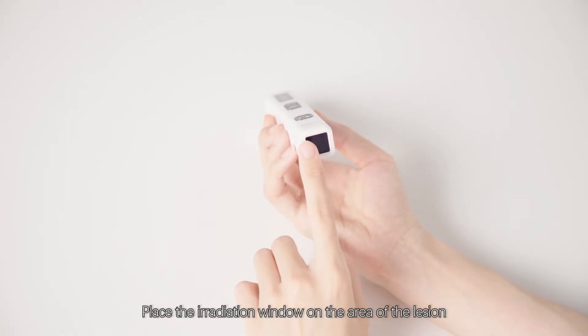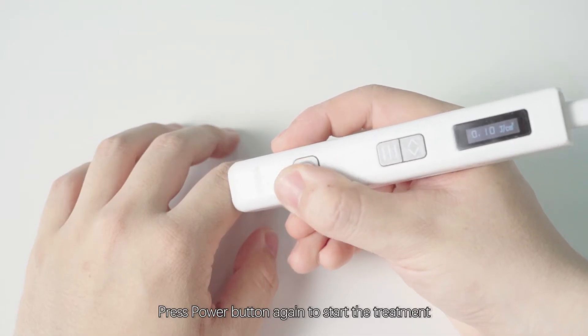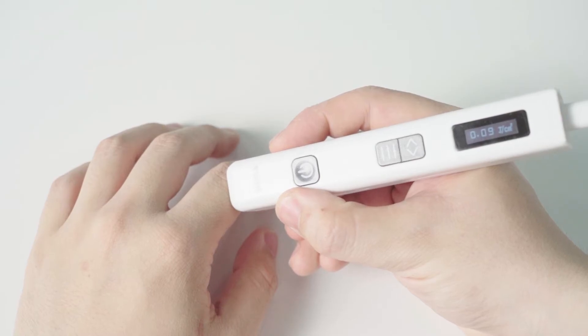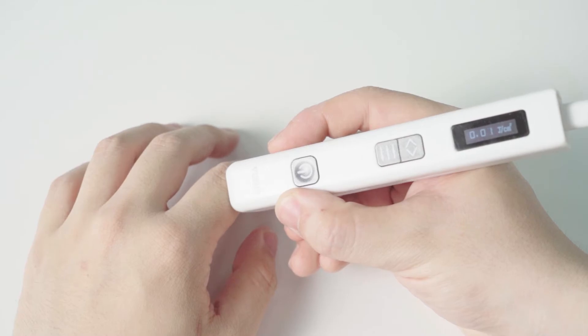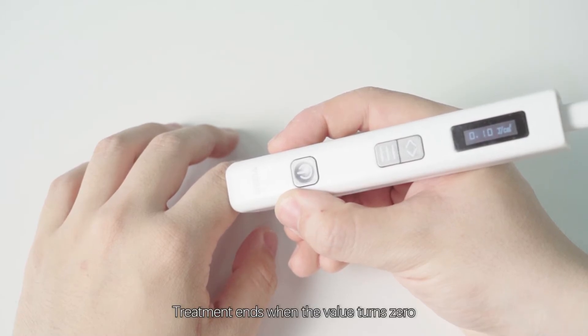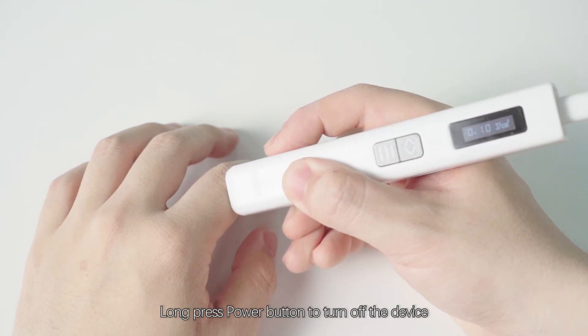Place the irradiation window on the area of the lesion. Press the power button again to start the treatment. The value on the display screen counts down. Treatment ends when the value reaches zero. Long press the power button to turn off the device.